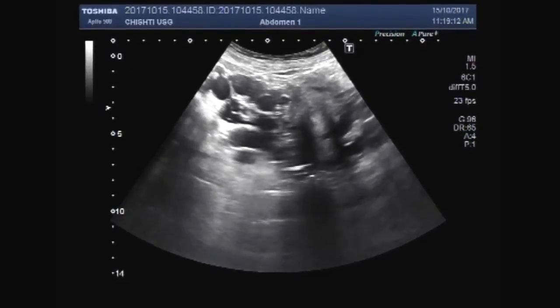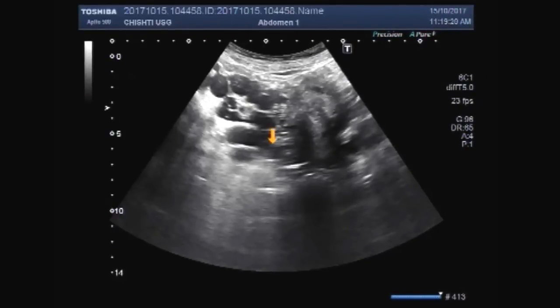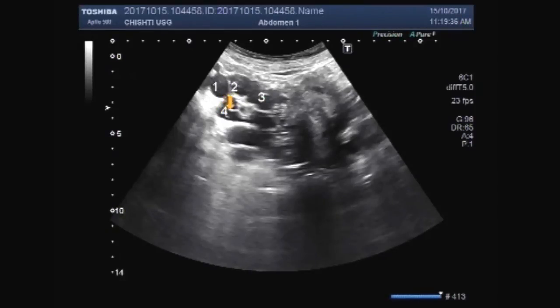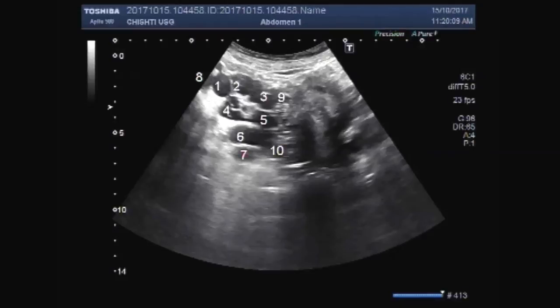Now we again focus the left ovary. We can count these follicles or cystic areas — you can count them. The size of the follicles is about 8 to 12 millimeters in diameter. This is the counting of the follicles.